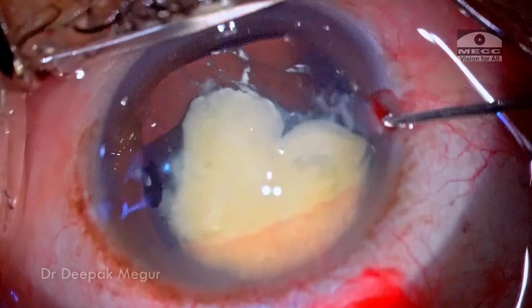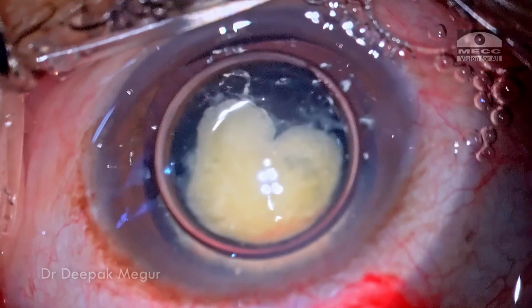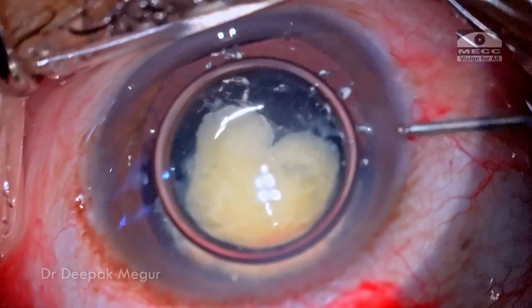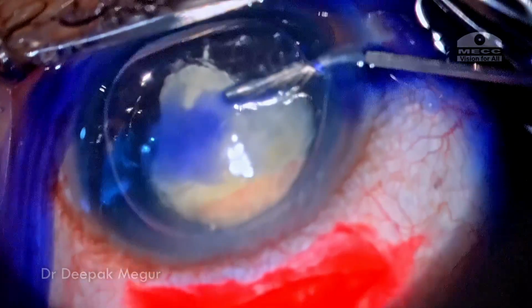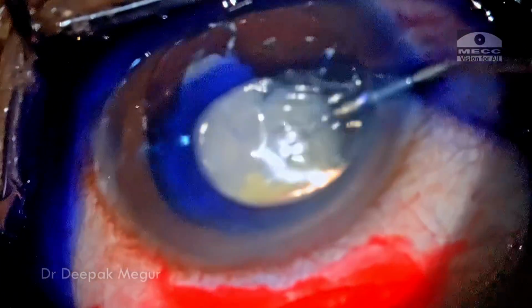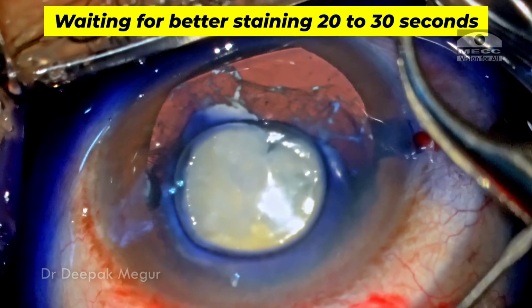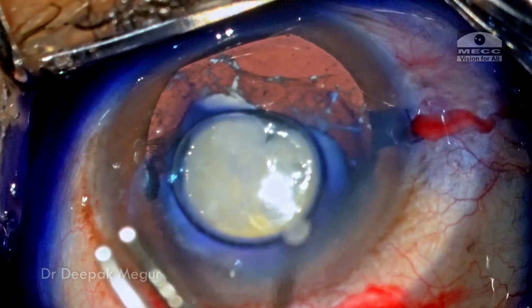While staining the anterior capsule, I am a bit concerned about the dye percolating behind the lens into the vitreous cavity, which could obscure visualization. So I'm using a very little amount of trypan blue. I'm just trying to paint the anterior capsule under the air bubble using a few drops of it. I plan to wait a slightly longer time, maybe about 20 to 30 seconds, just to ensure that the staining is appropriate.